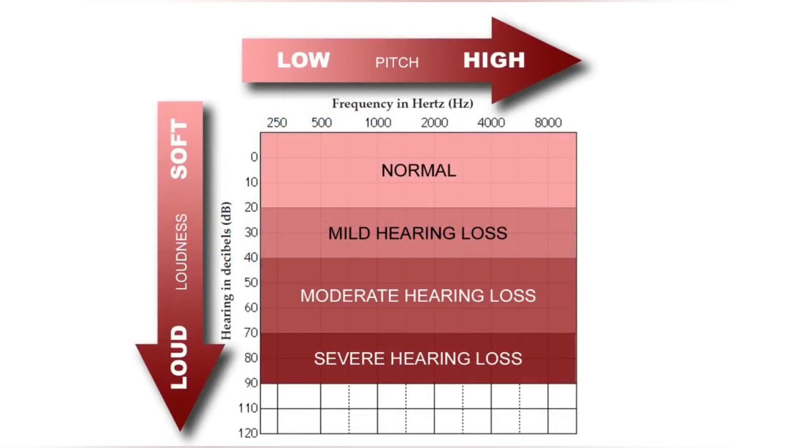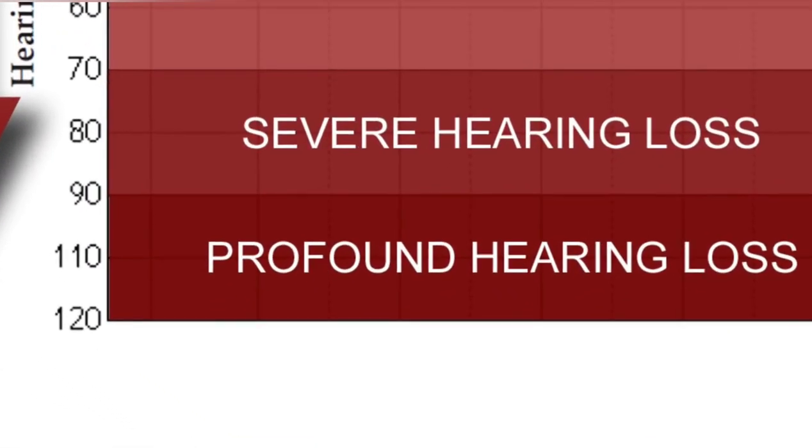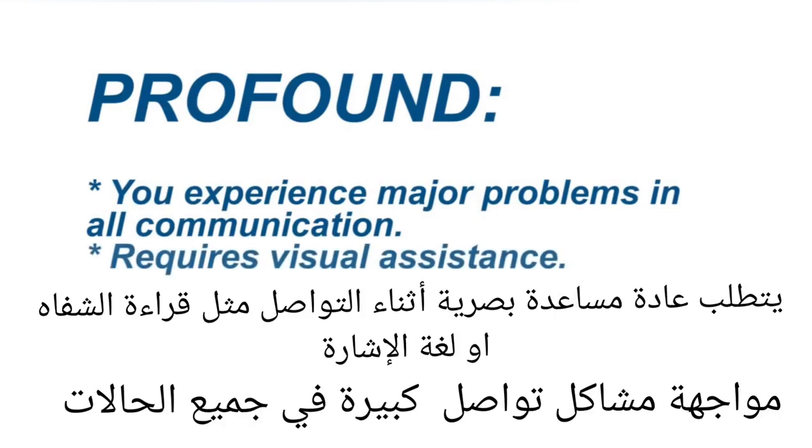And if your hearing loss is profound, you will see the mark in the 90 to 120 decibel range. At this level, you are having major communication problems in all situations. Profound hearing loss typically requires visual assistance while communicating, such as lip reading or sign language.